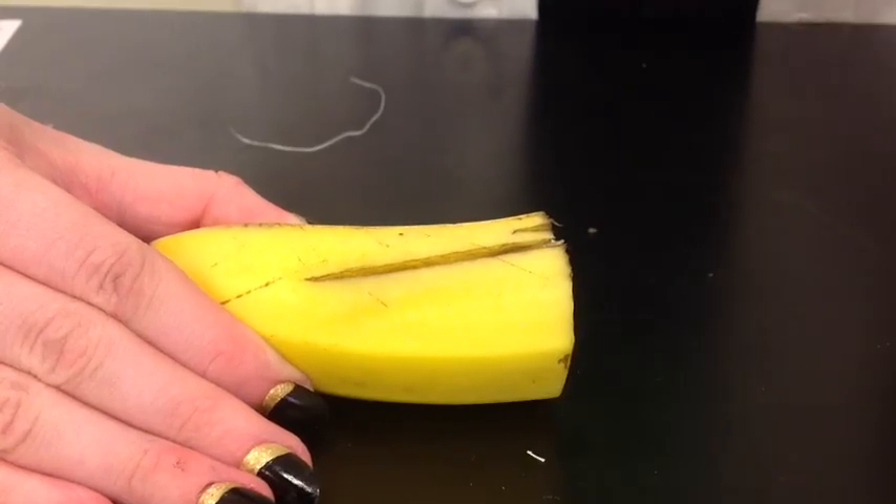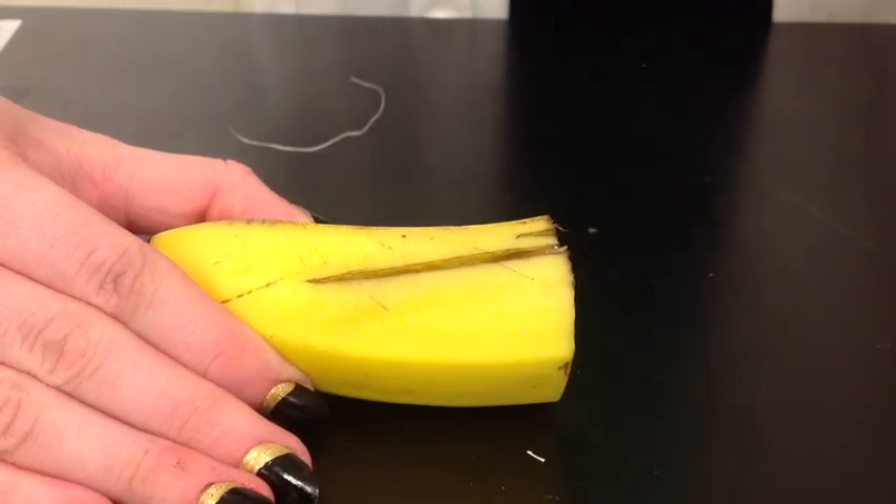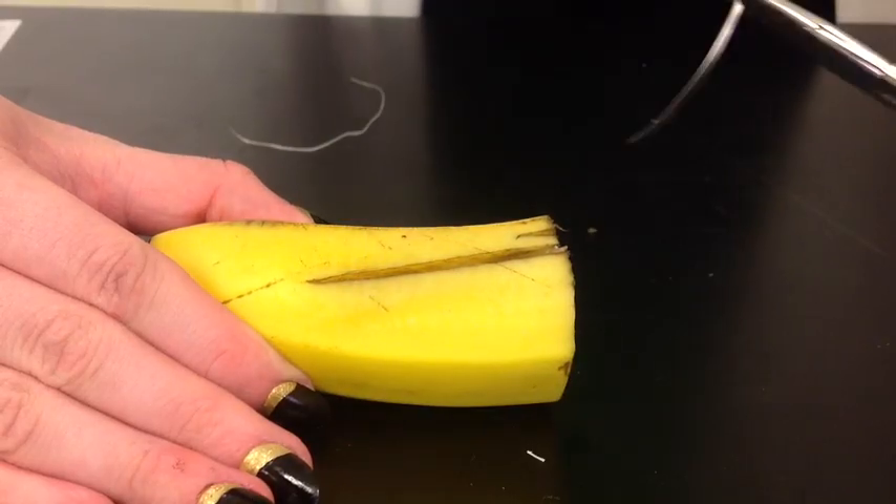One nice thing about the bananas in this case is that it'll turn black if you are doing it wrong. In other words, the more you do it wrong, the more black the banana is going to be. You're going to have some oxidation — the banana is exposed to the air, so it's going to happen a little bit. But the more you have to redo it a couple of times, the more black the banana is going to be.